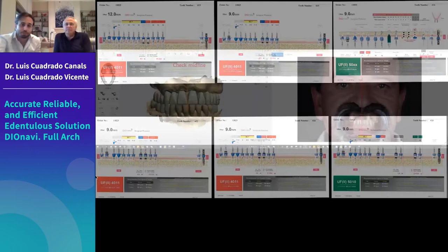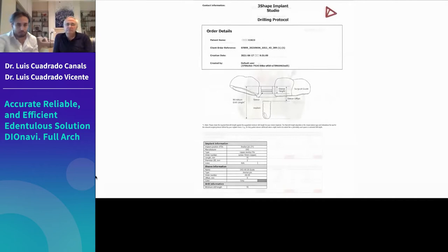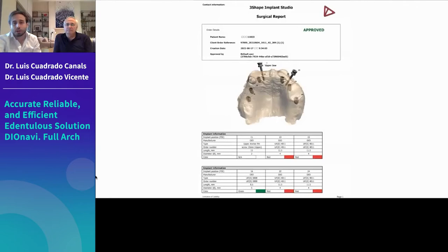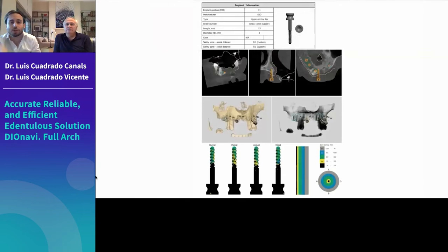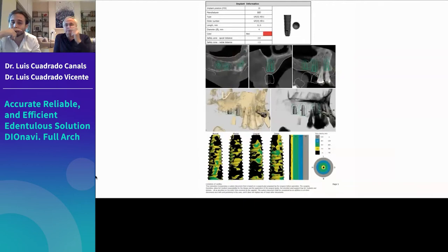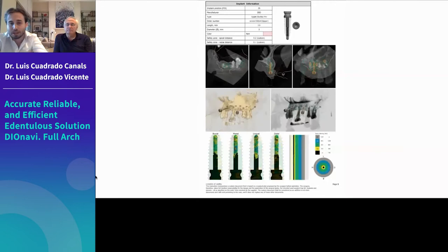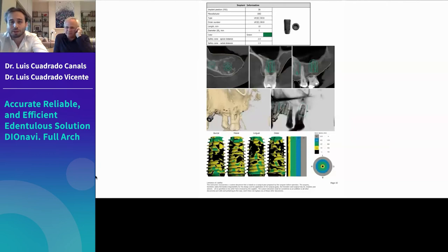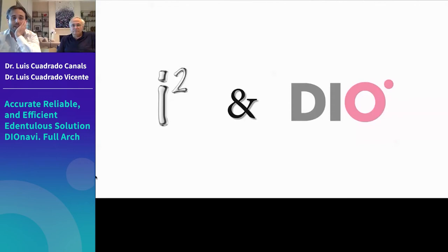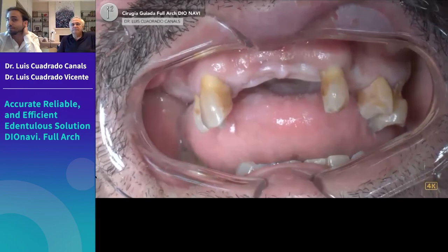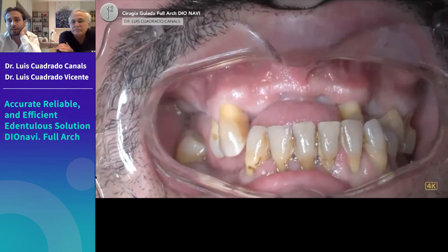Check the midline and everything on the provisional prosthesis. The surgical report is a really useful tool — it shows the type of bone you'll encounter, helping you decide in advance whether under-preparation is needed. The greyer the area in the report, the more under-preparation is needed; green or yellow areas require less or no under-preparation.